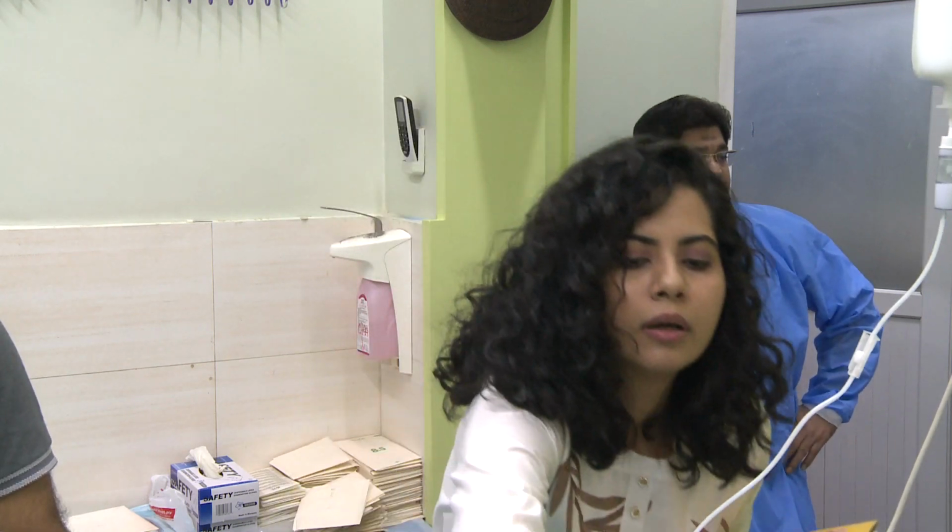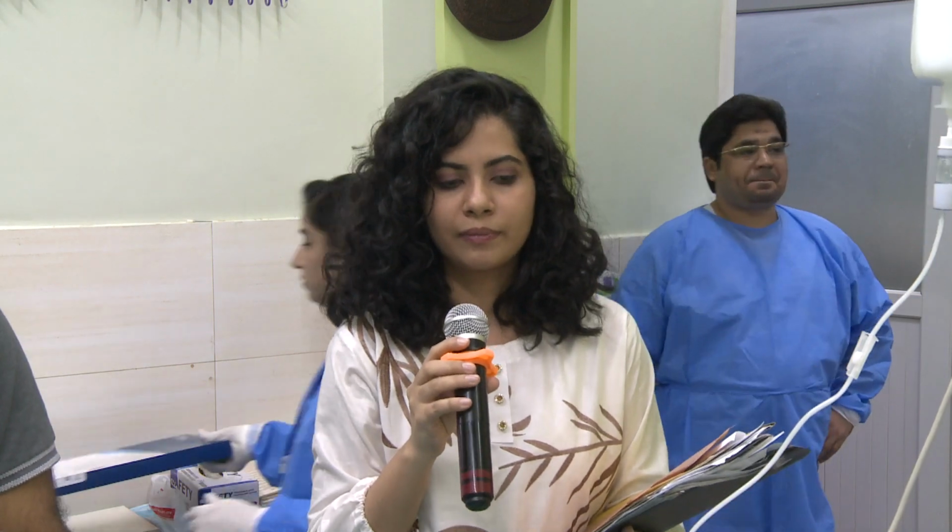In the PD. Where was the stricture exactly? In the distal half of the CBD. Distal half of.